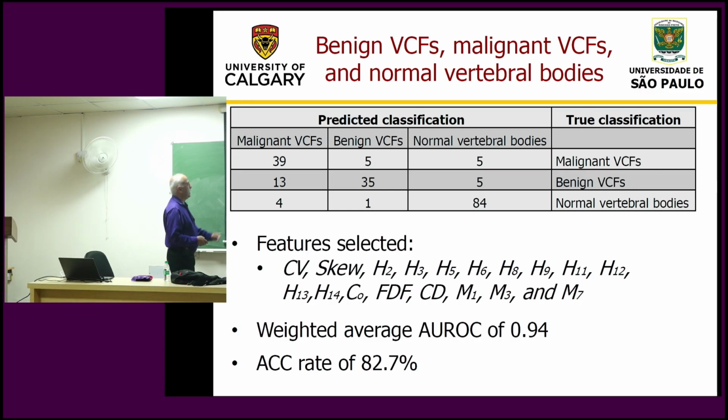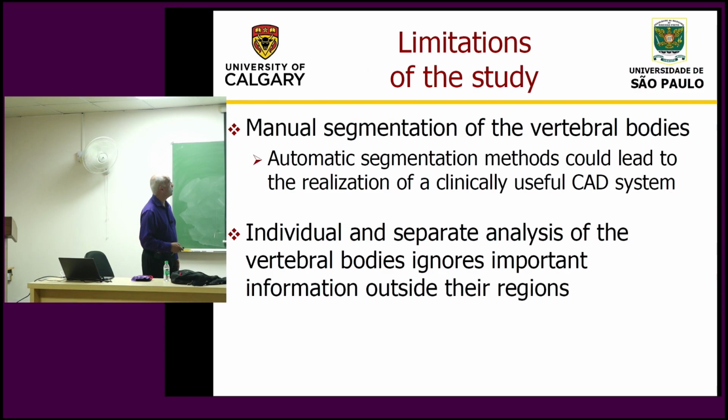Depending upon the problem posed in terms of what you are classifying, the pattern classification method used, and the feature selection method rather, you may get different features selected. In this case, a large number of the features were selected, almost all of the Haralick features and 3 of the moments and the other features we defined. That's perhaps too many features for this data set.